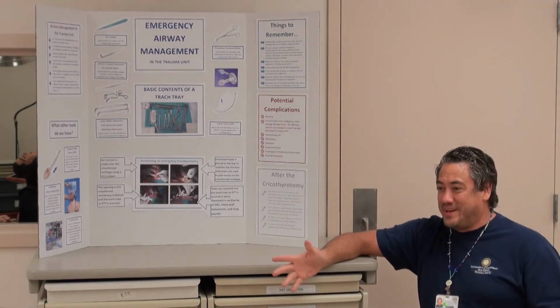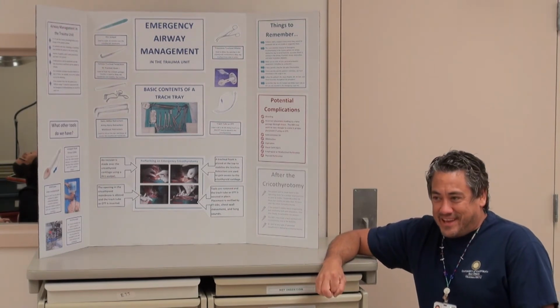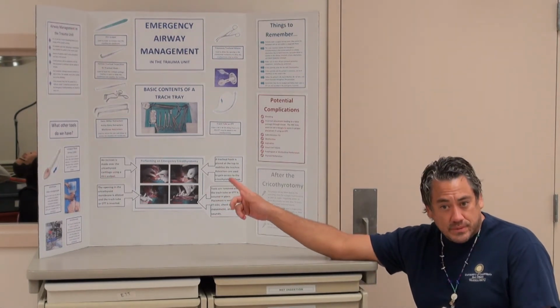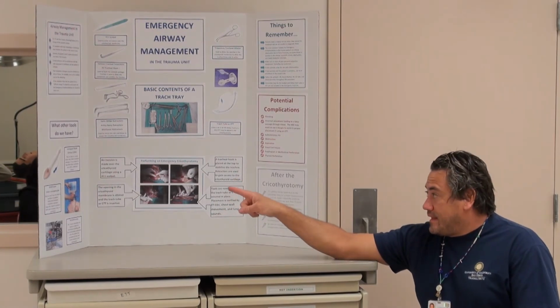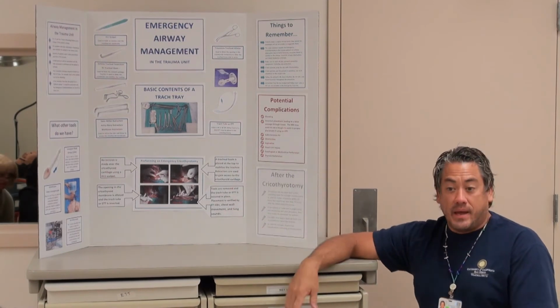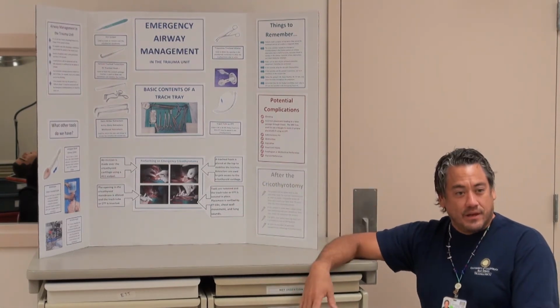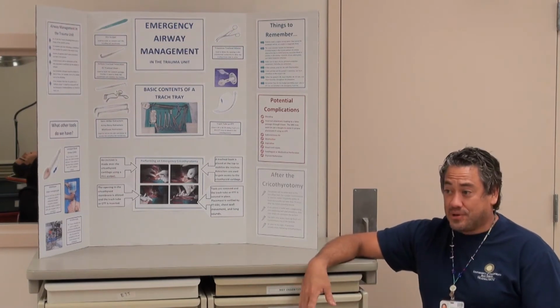Has everyone here had to do one? It's not a comfortable thing. I haven't seen them in a while. Yeah, and I think just because we have a lot more tools to be able to do it. The Glidescope is great. And I think that LMAs, I had one that we were having a ton of trouble with, and they just stuck that LMA in there, and we were able to ventilate them, got them back up, and then they got the Glidescope out, and the patient never dropped his sats, never looked uncomfortable. It was really nice.